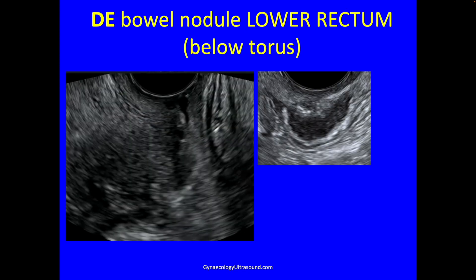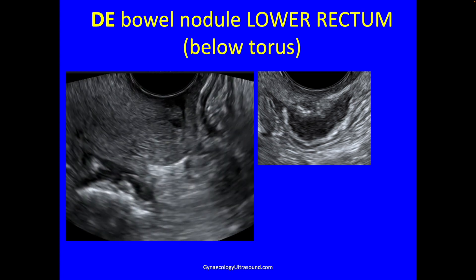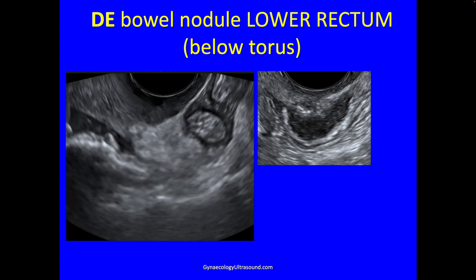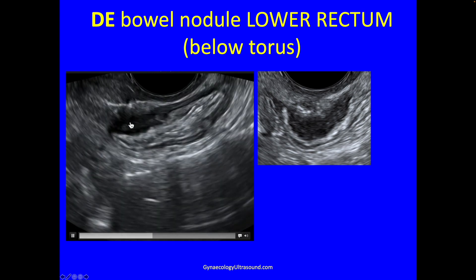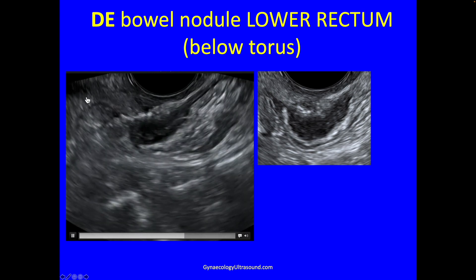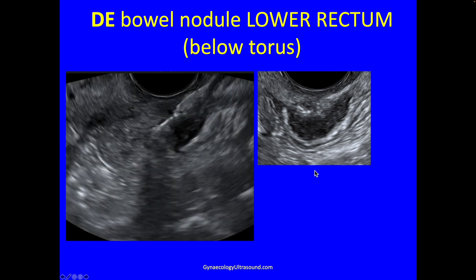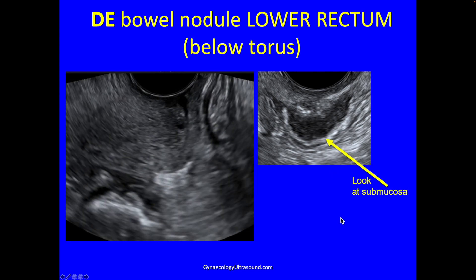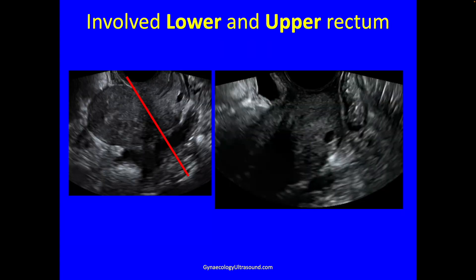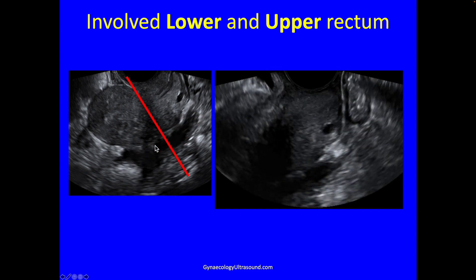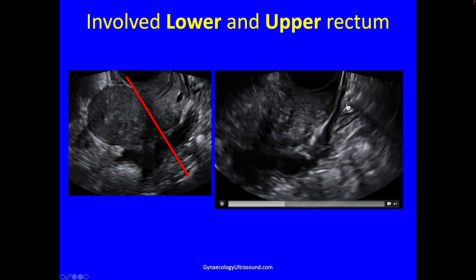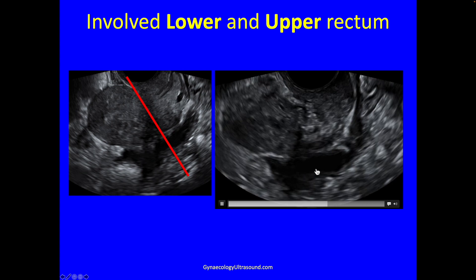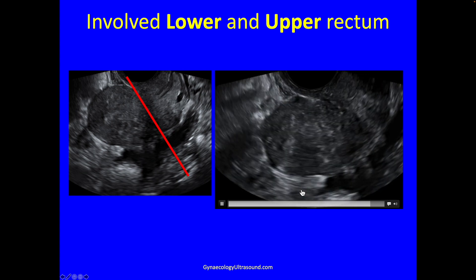Then you can determine where in the bowel the nodule is. This one is in the lower rectum — we're below the level of the torus. You can track muscularis there and almost immediately there's this nodule; we're nowhere near the internal os. The line through the internal os to the torus — point of attachment of the uterosacral ligaments — defines lower rectum versus upper rectum. In this video clip you can track muscularis as you enter the vagina, and then there's this big plaque that goes right across the level of the torus.